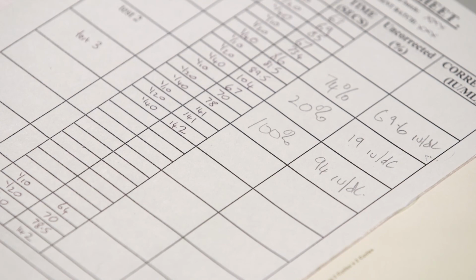So we didn't meet all the criteria for a valid assay. There is interference. I think we're safe because these 2 show a straight line parallel to the standard, and it's clear that this has a normal concentration of factor VIII. Just keep in mind, why would we be doing a factor VIII assay in a patient that turns out to have lupus anticoagulant? Most frequently it would be because we've seen a prolonged APTT and we want to be reassured that it's not caused by mild haemophilia or mild von Willebrand's disease, perhaps prior to surgery or for some other reason.